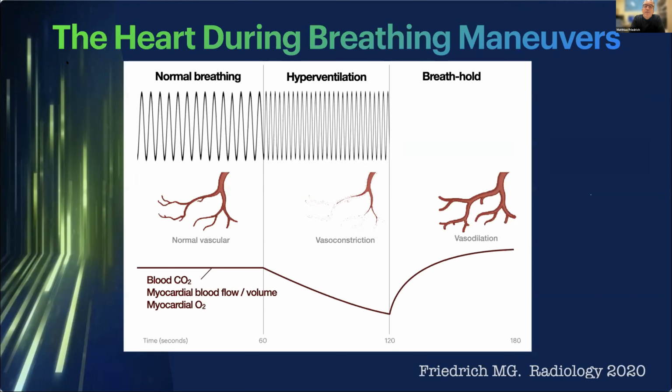And depending on the length of that breath hold and when you acquire those images, or if you do this free breathing, I think this may actually lead to different results of the first pass perfusion scans. So this is maybe a not insignificant confounder, and you can of course control for all of that. In fact, get rid of that confounder by using just a breathing protocol as we have here, where you control exactly that very important factor in the vascular tone.